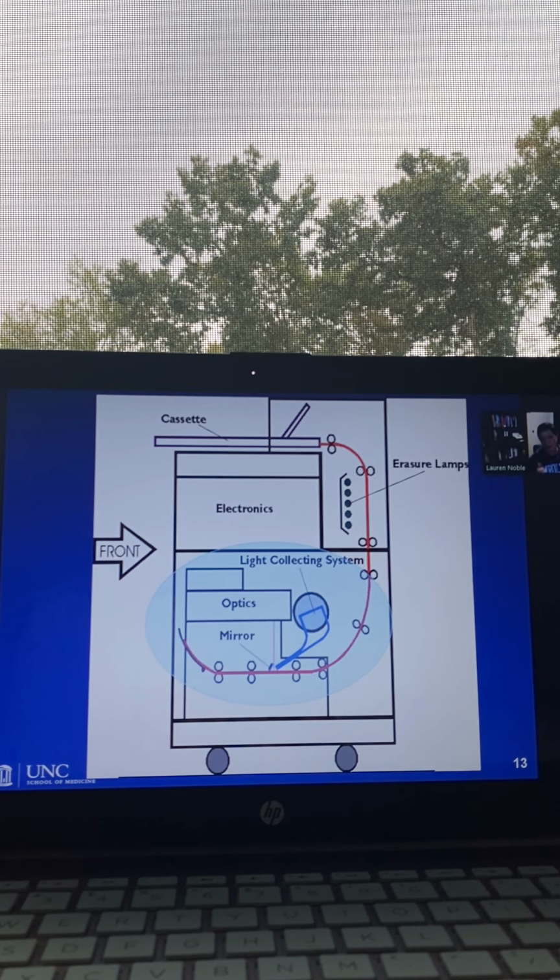You need to take this cassette and set it aside for 8 hours and let the energy dissipate on its own. Do not use this plate because you will end up with low contrast images and ghost images. There's too much remaining image data on this device. So yes, it is possible to have too much information left because the exposure was so high.